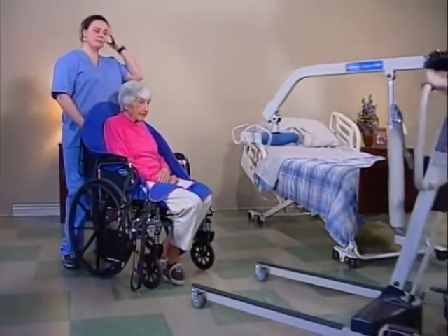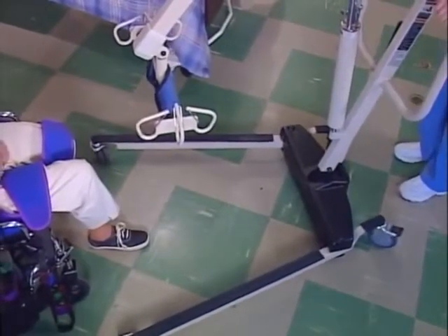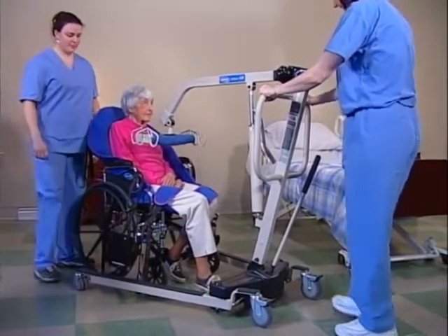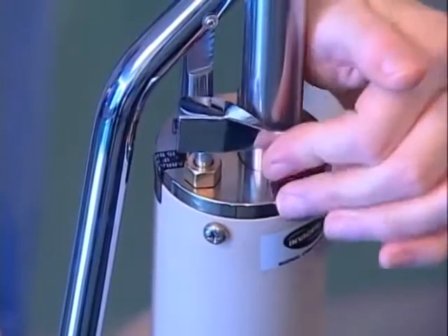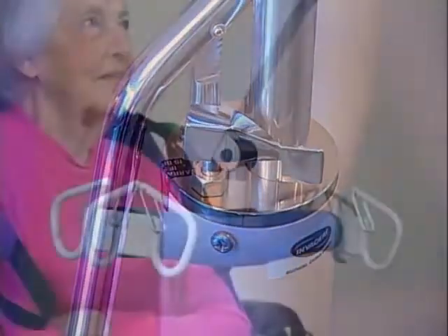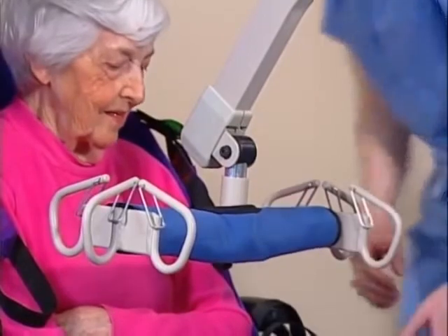Position the lift so it's over the wheelchair. Make sure the lift's legs are in the maximum open position for stability. Lock the lift's rear casters to prevent it from moving while you attach the sling. Turn the control valve on the hydraulic pump counterclockwise to lower the boom. Position the swivel bar so that it is parallel with the resident's shoulders.